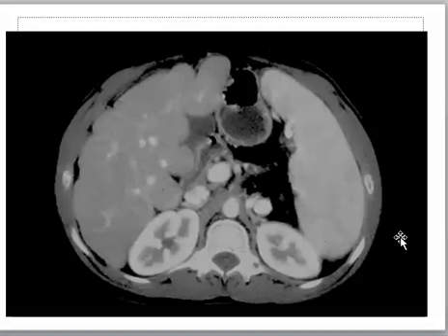Usually the spleen is between the 9th and the 11th ribs, so it is enclosed between 3 rib distance, one space and one space, 3 ribs. But here, if you measure this, it is exceeding the 3 rib concept, so that means that it is much enlarged.